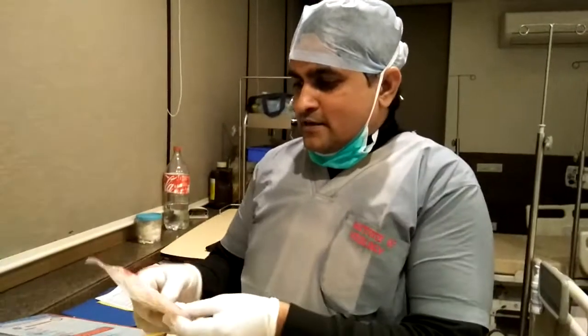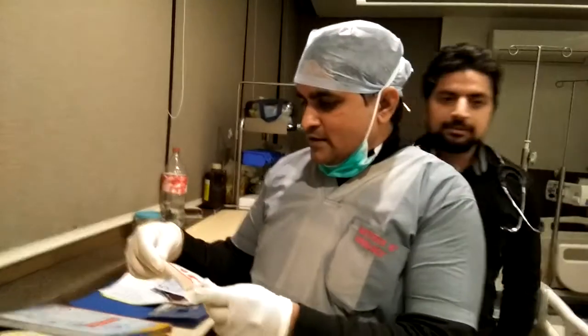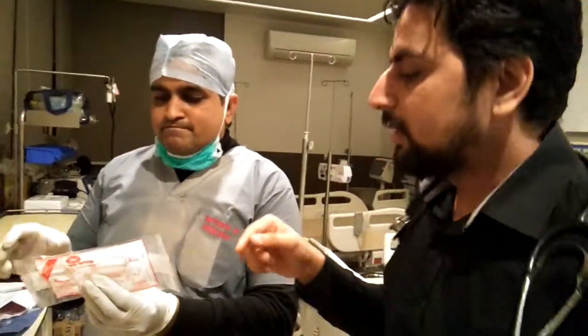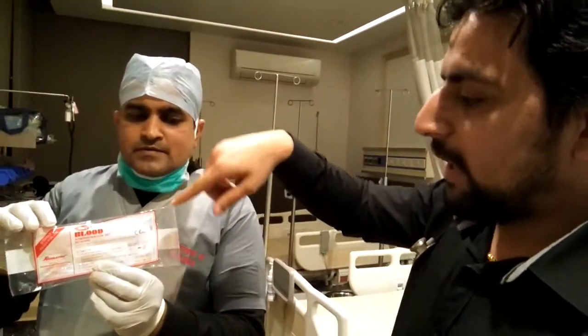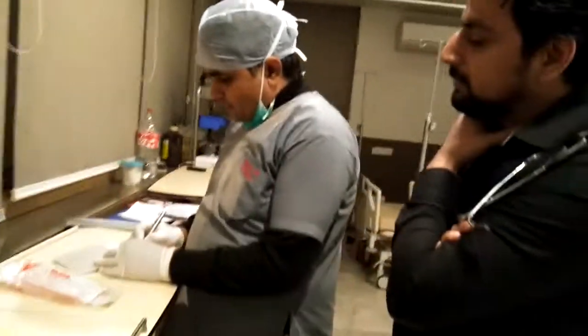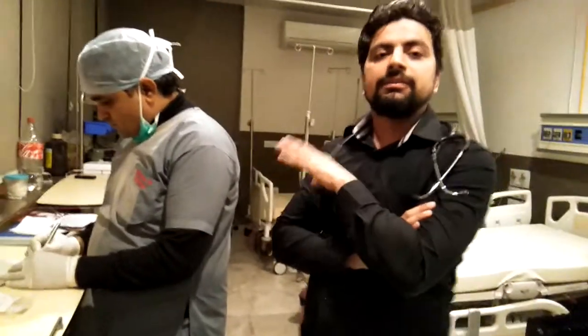Age, registration number — everything is mentioned here. Now we are going to transfuse. Mr. Ashutosh is going to show us how to transfuse, and ICU worker hello. Now I am going to verify this blood group. I already explained — this blood group is already verified by the issuing officer, blood bank, and cross match already signed.